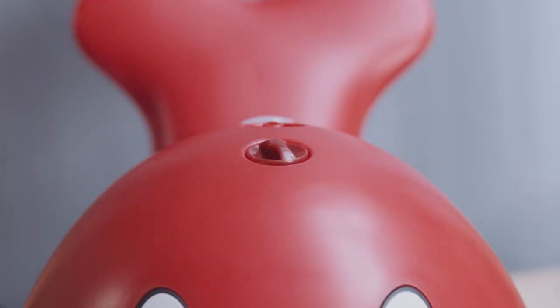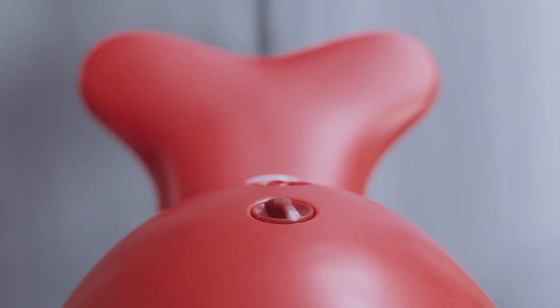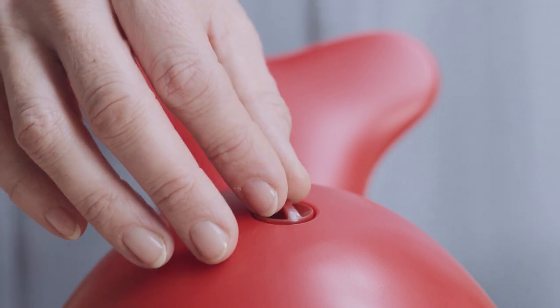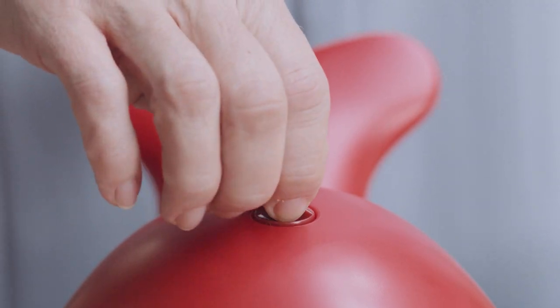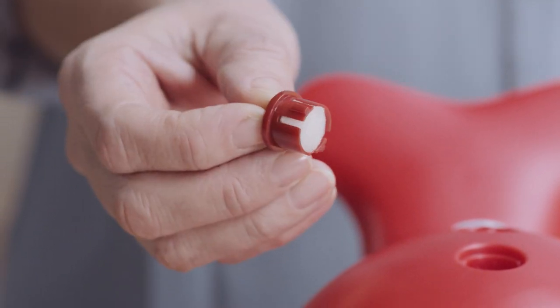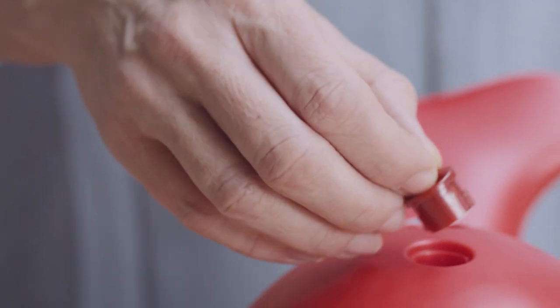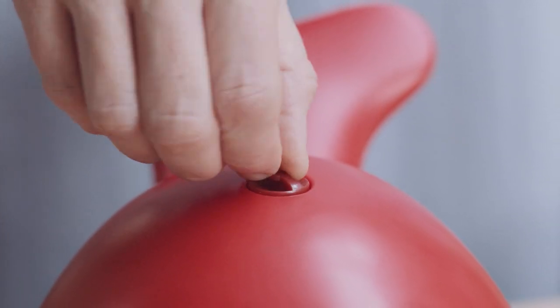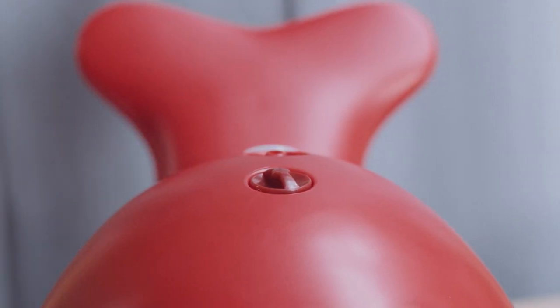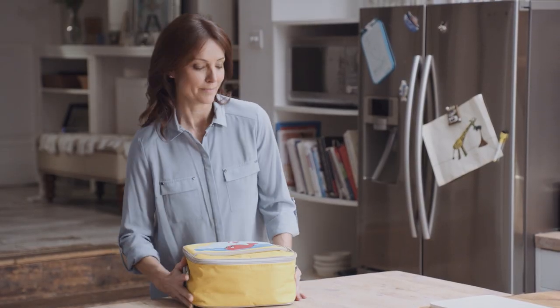The filter should be checked regularly and replaced when it becomes discoloured or dirty, clogged or wet. To change the filter, remove the filter cap by gently pulling it out. When replacing the filter, make sure it is fully inserted and twist it to lock it in place. Don't wash or reuse the filter and don't use the unit without one.